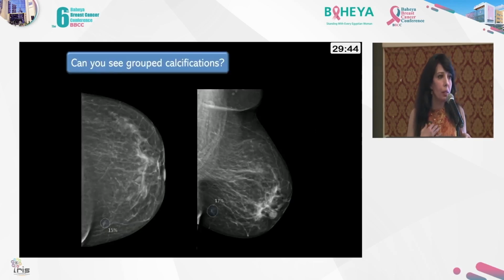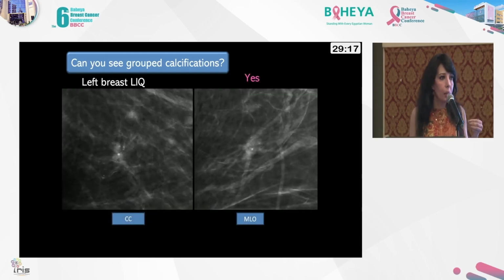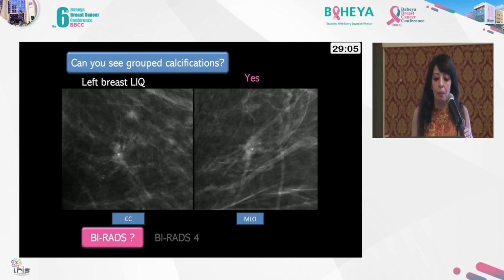For me, in my experience, there is nothing to exclude when I get to the no man's land. It is a suspicious lesion, although it looks benign, because the ones with benign and malignancy are in the glandular tissue. Anything outside the glandular tissue, unless it is an intramammary lymph node, I should consider malignant unless proven otherwise. So when I found this lesion, the AI gave it only 17%. I asked for a biopsy. It's a little bit distorted and has these 1, 2, 3 punctate calcifications, yes, it's not too much, but I couldn't give it the chance for follow-up, especially if the patient is 52 years of age. For me, it was BI-RADS 4 on the imaging, although the AI tells me it's probably non-cancer.